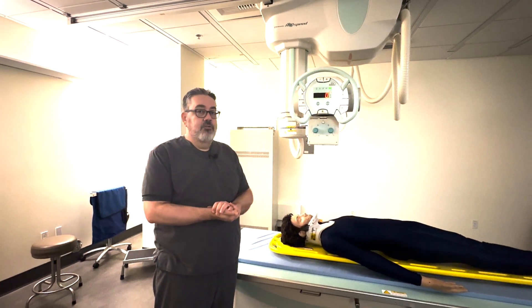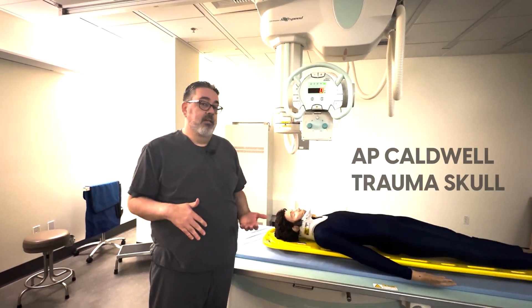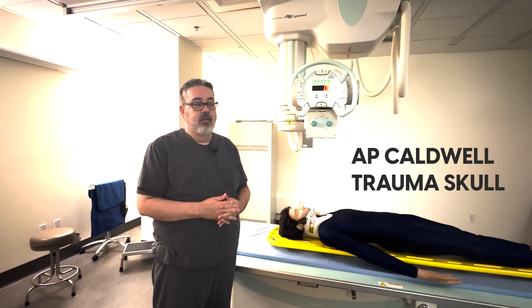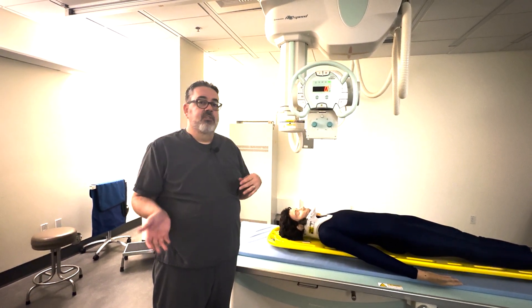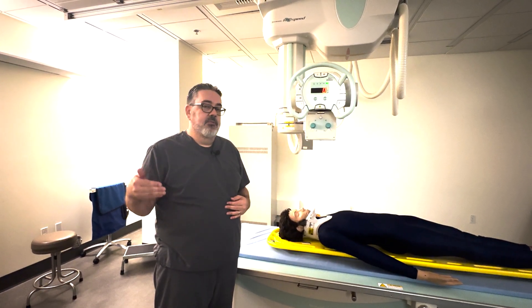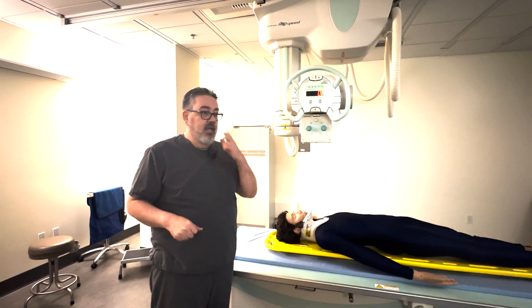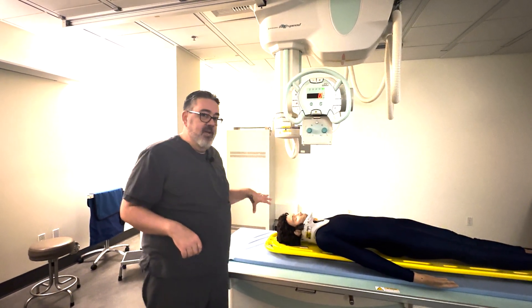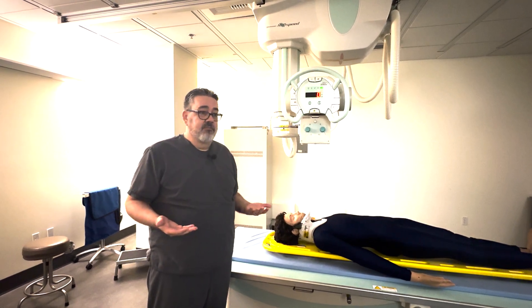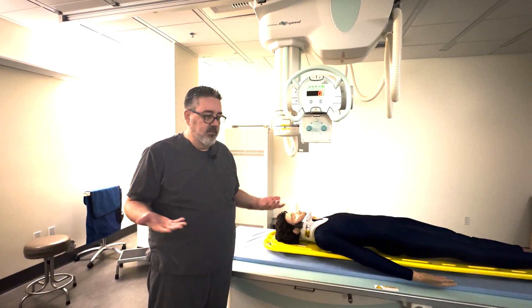We've done the AP trauma skull. Now we're going to switch to the AP Caldwell. Traditionally, we do our Caldwell's PA upright. However, if we switch to an AP projection, that's going to cause us to have to angle cephalic 15 degrees instead of caudal. And if we can't move the patient, as in any trauma, we need a method to be able to find how many degrees to angle from the OML. So that's what I'll demonstrate here.